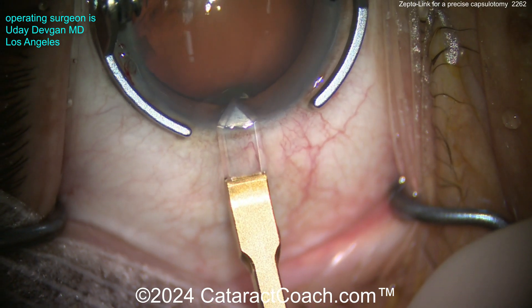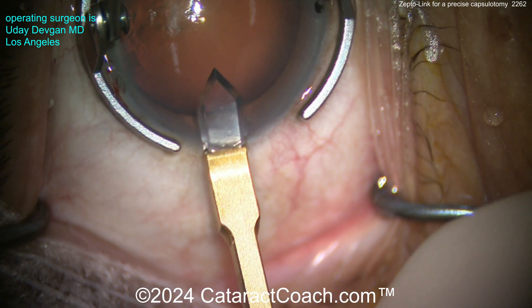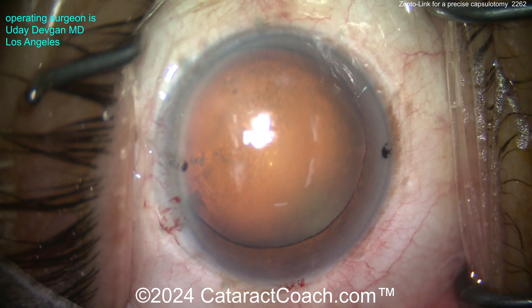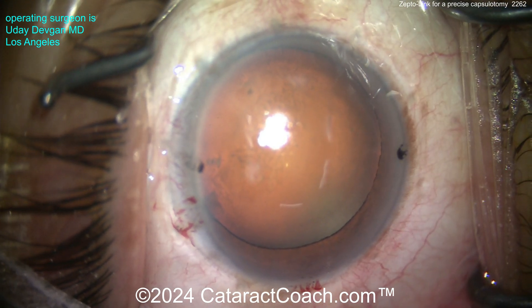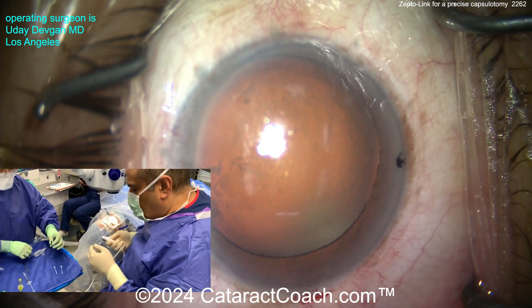Here's a routine cataract case — actually a tough case, a high myope. We're going to put a toric lens in. You can see we're making about a 2.2 millimeter incision. Any size incision — 2.2, 2.4, whatever you've got — it's all good with the ZeptoLink. My technician is handing the device to me.